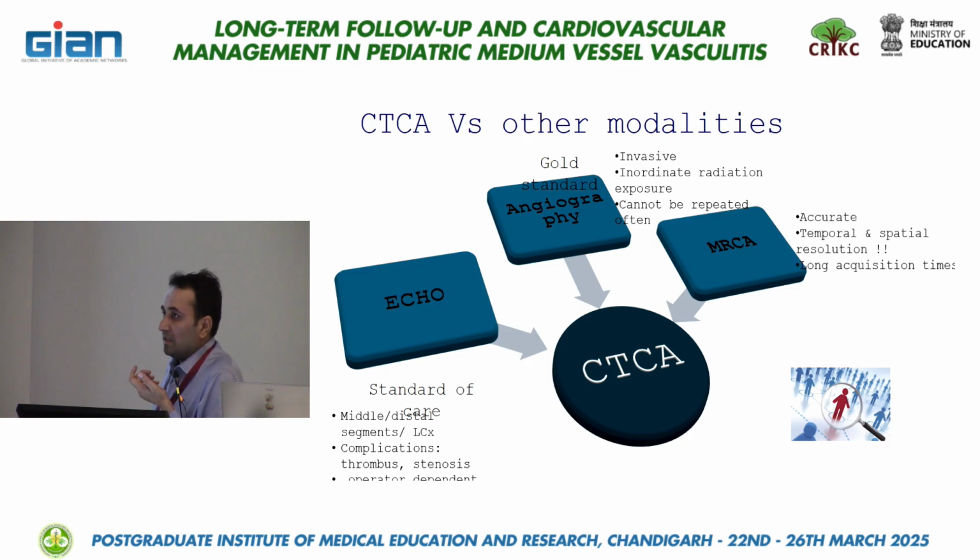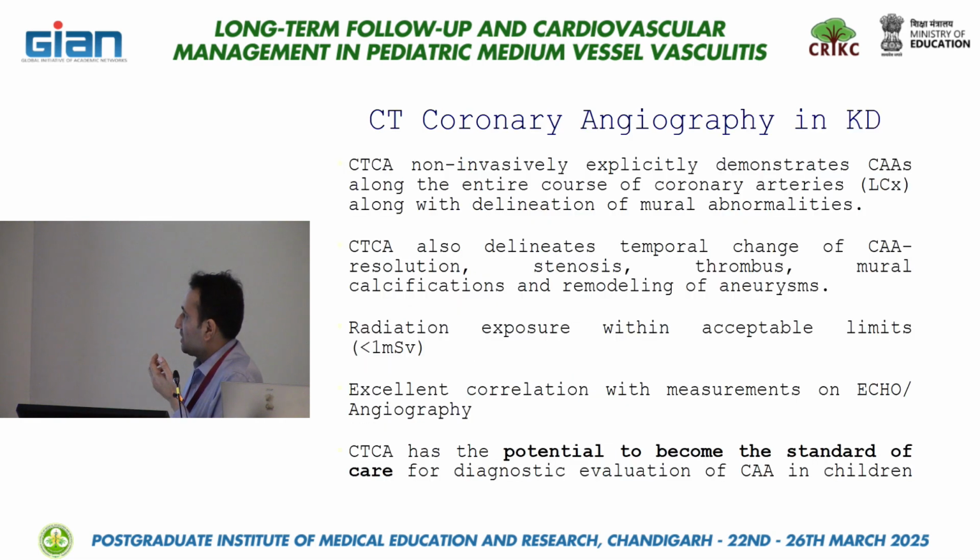MRCA is definitely an imaging of choice if you can do it, but the problem is long acquisition times, and in small children you can't perform that, and its temporal and spatial resolutions are limited. So therefore we have CT coronary angiography, and CTCA is non-invasive, on current standard high resolution CT scanners, where we can also control the radiation exposure.